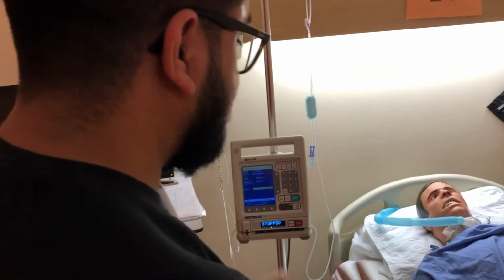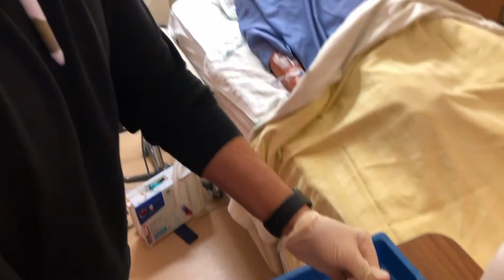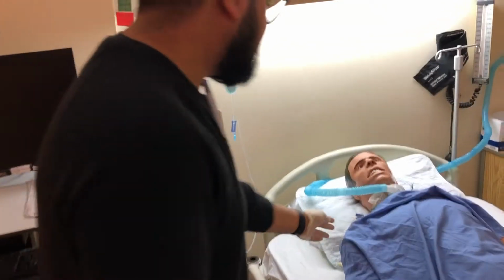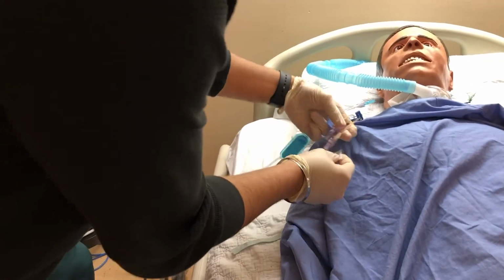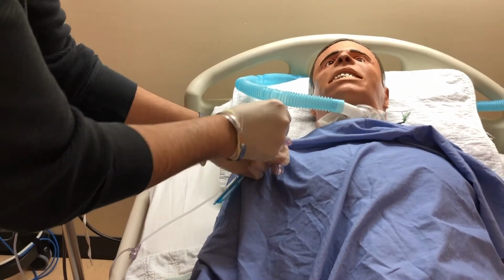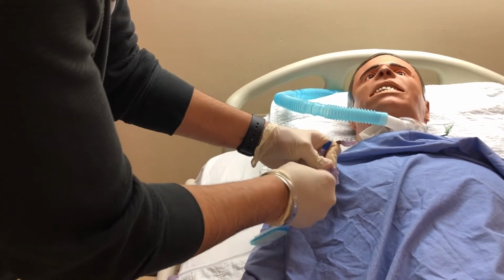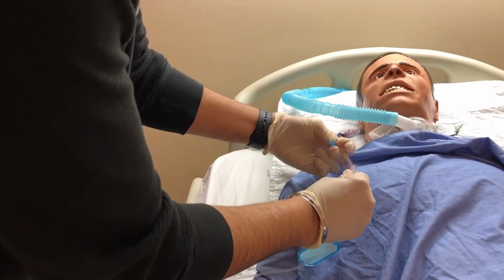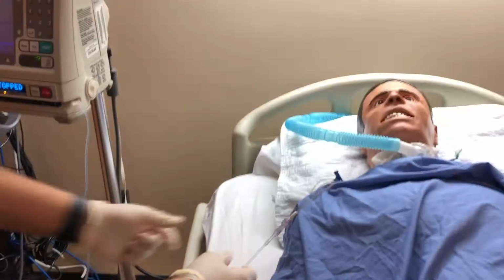Now what I could do is attach it to the CVAD port that I had originally already flushed for patency. So I would get this, get my port here. You would clean for 30 and dry for 15, making sure you're maintaining sterility there.